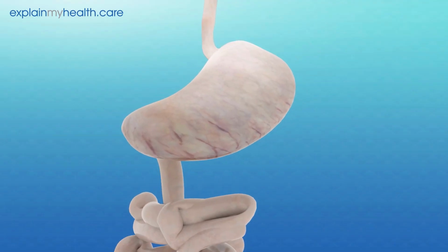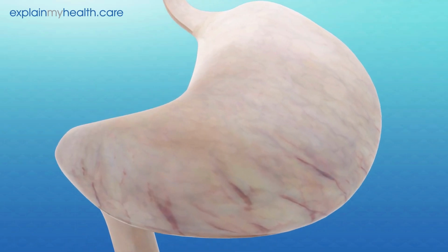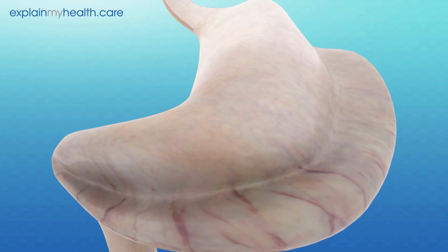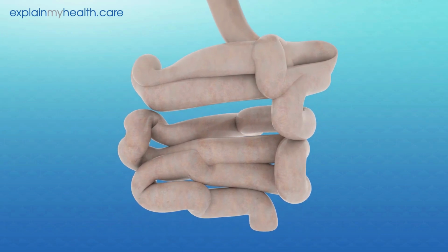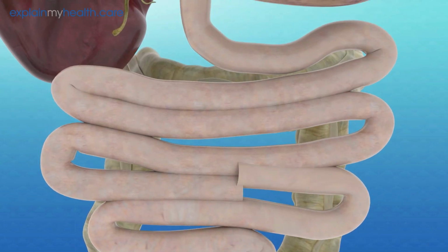During the first part of the procedure, the size of the stomach is reduced by stapling it. The staples can be placed in a variety of locations to achieve this, depending on your requirements. The second part can vary again, depending on your requirements, but usually involves the division of the small intestine.